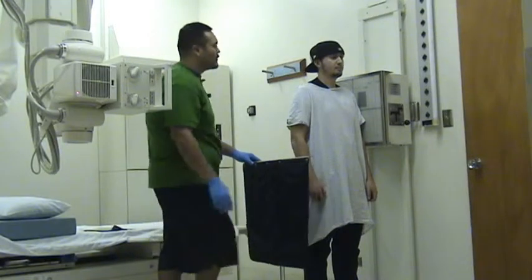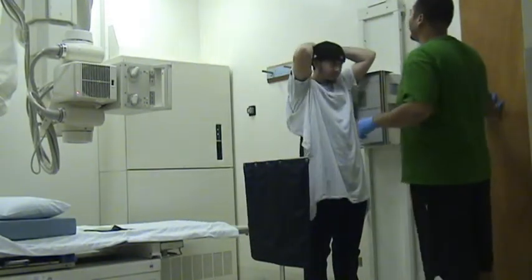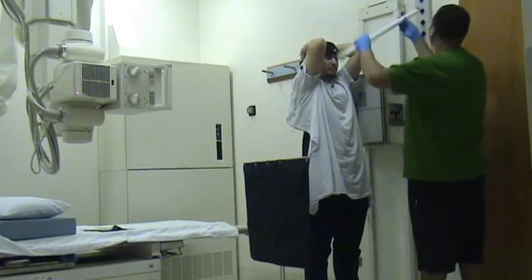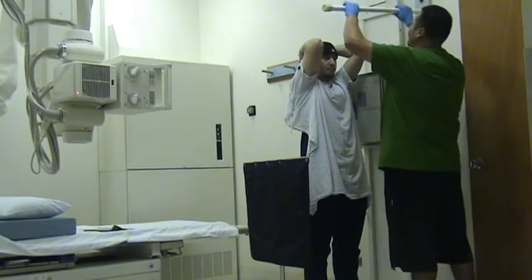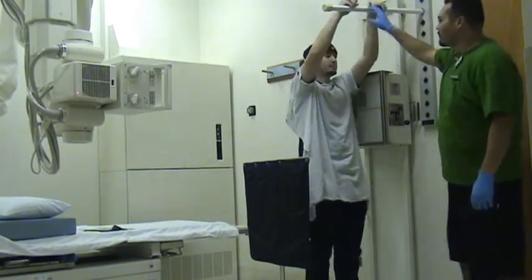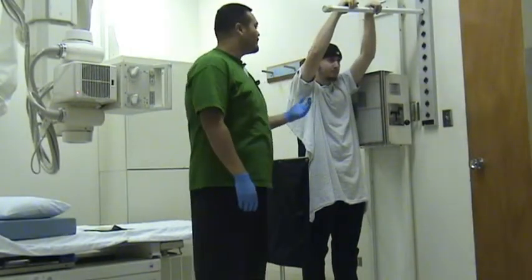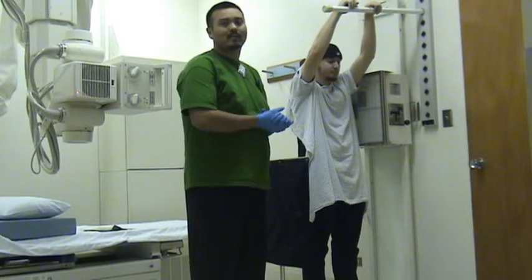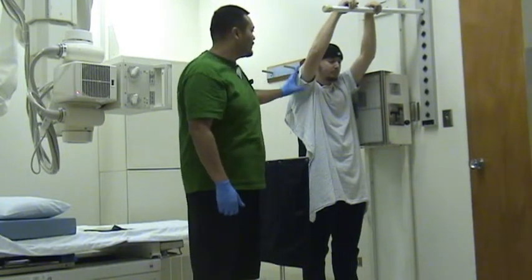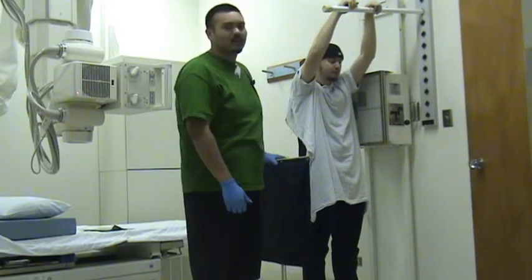Always shield the gonads as well. So go ahead and bring your arms up. You can, there you go, perfect. Behind your head and bring them close. If they're unable to do that, you can always use a tube like that. You can always use one of these they can grab onto. Go ahead and grab onto here, just demonstrate. Perfect. Or you can always use an IV fluid pole for any patients that are having a hard time bringing their arms up. What this does is it brings this part of the arm out of the apices of your lungs and gives you a clear shot.